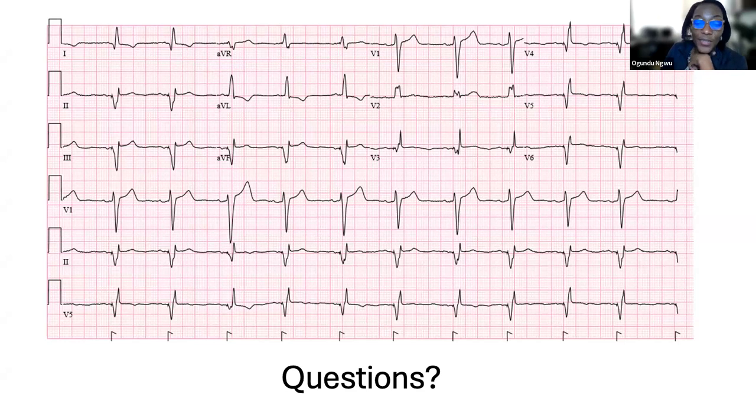Of patients that I couldn't get an LV lead in at the time when I tried to do their BiV. So what I did was I capped it with a view to come back in a few months, because sometimes you have the valve, it's just impossible to get past that valve. And after 50 minutes of fluoro, you have to stop. So this young patient, I'm going to bring this patient back and try again to put in a CS lead, because sometimes you come back and the valve is open. You're like, I don't know what happened the last time, but at least I know that I'm already planning.